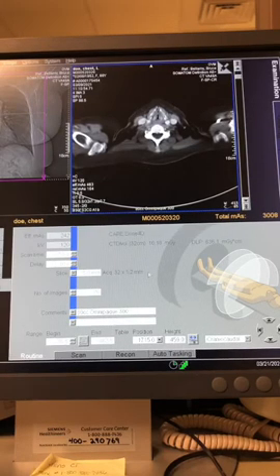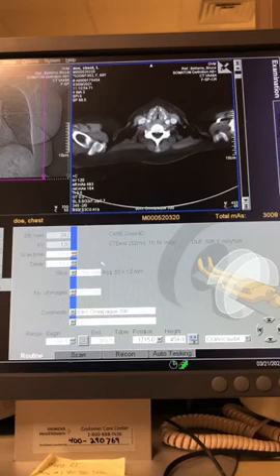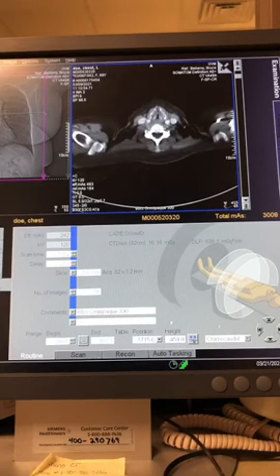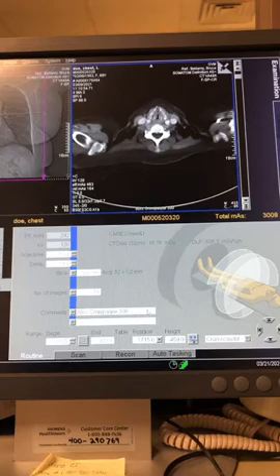When you guys are creating your protocols, it's perfectly fine. Like if you're going to give the slice and the acquisition, here you go. It's just laid out. If you have a Siemens, you can just check that out on any of the scans at your facility that you're going through, or Google it, whatever. Text me, it's cool. And then there's some annotations, 80 cc's of Omnipaque. That's how much contrast we use for chest.